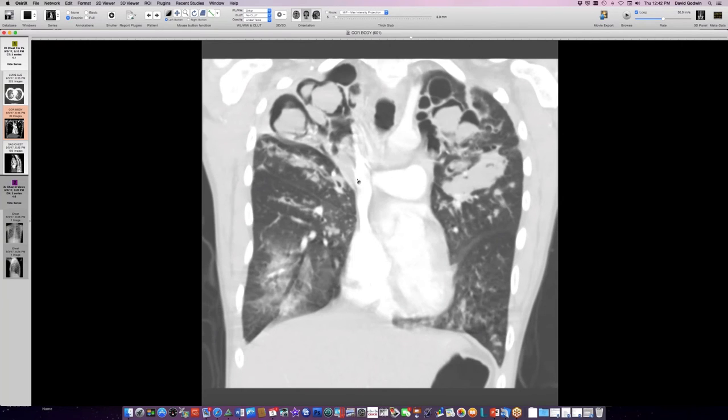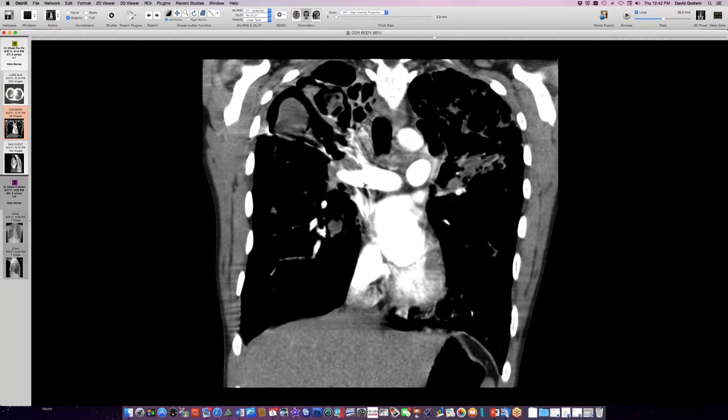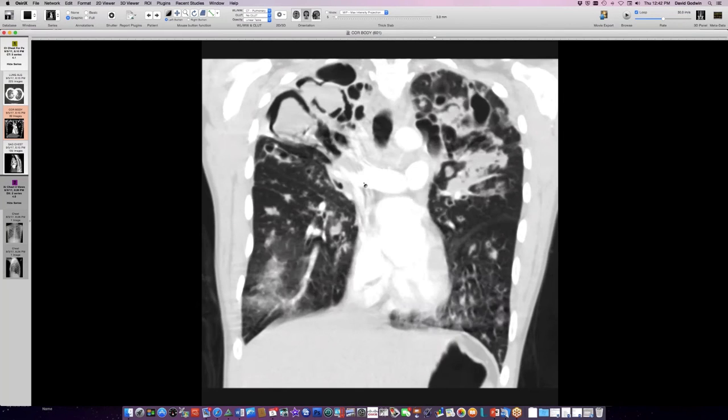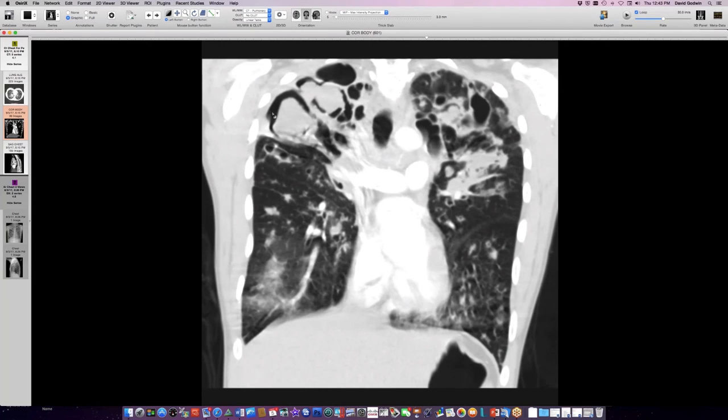You know, the lucency around it is the Monod, M-O-N-O-D, Olivier Monod sign. I'd have to check, but I think Monod, the Frenchman, described it as a bronchocele containing the fungus ball. I'll have to check. I think he used the term bronchocele in his description of it back when. I do have the article, so I'll pull it out.